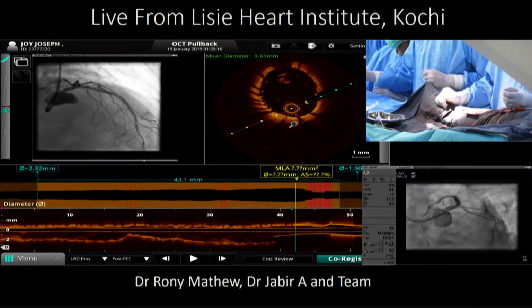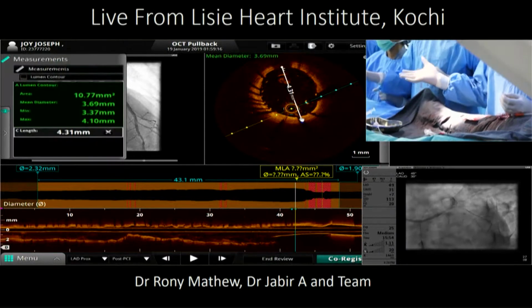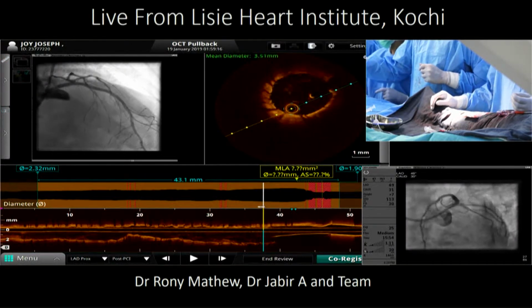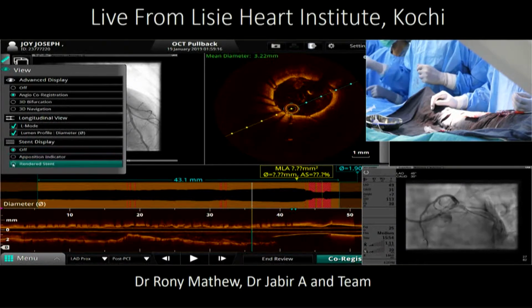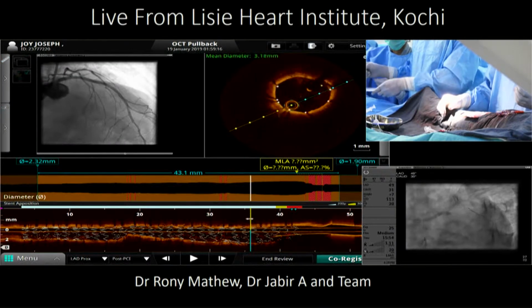4.5. What do you think the size of that balloon should be in the left main? A 4 or a 4.5? I will suggest a 4.5. Yeah, 4.5. Right, I do agree, because there it is at least 4.3 over there with an EEL of 4.5. Can we go to rendered stent and a bifurcation view where we see the bifurcation of the circumflex, please? Yes.